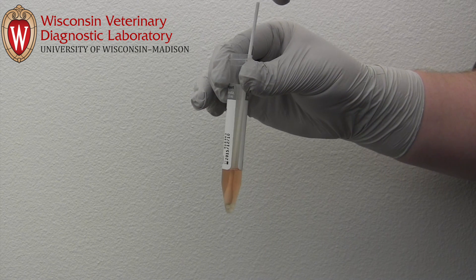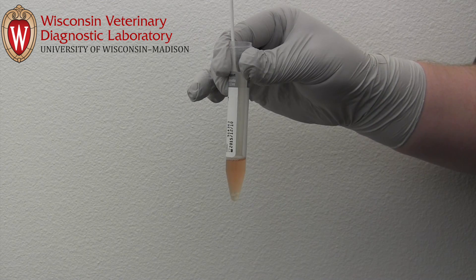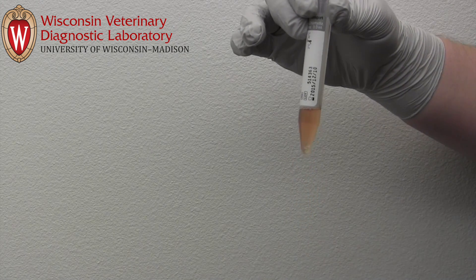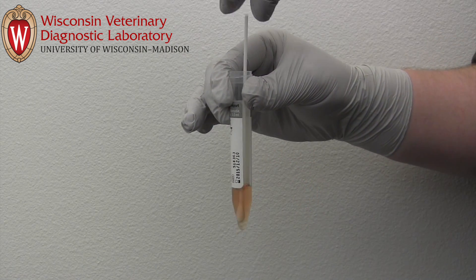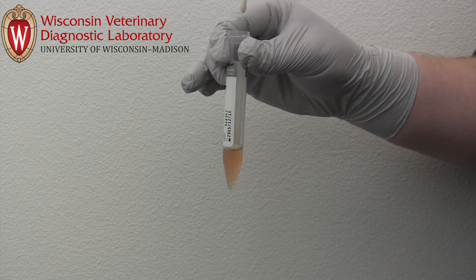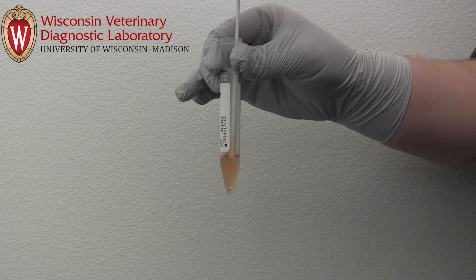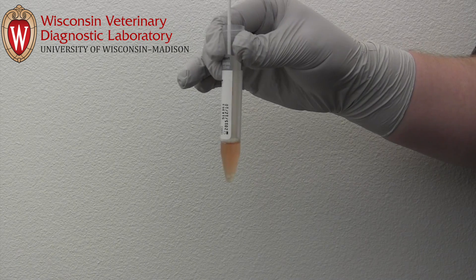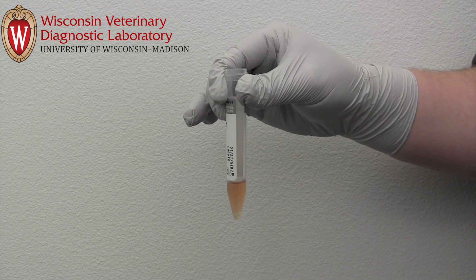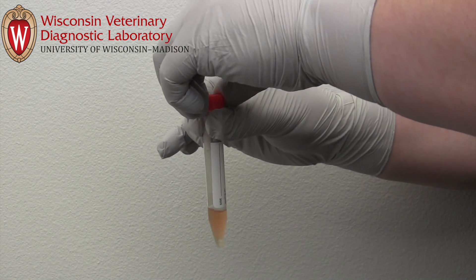When inoculating the broth, insert one swab at a time with a maximum of five swabs from five different birds. Uncap the tube, insert a swab, then gently stir and agitate for approximately five seconds. Before removing the swab, press the tip against the inside of the tube in order to squeeze out the broth. After inoculation, each swab should be removed from the tube. Before discarding in regular trash, we recommend soaking swabs in a 10% bleach solution to destroy possible virus. Repeat this procedure with additional swabs using up to five per tube. When finished, securely recap the tube.